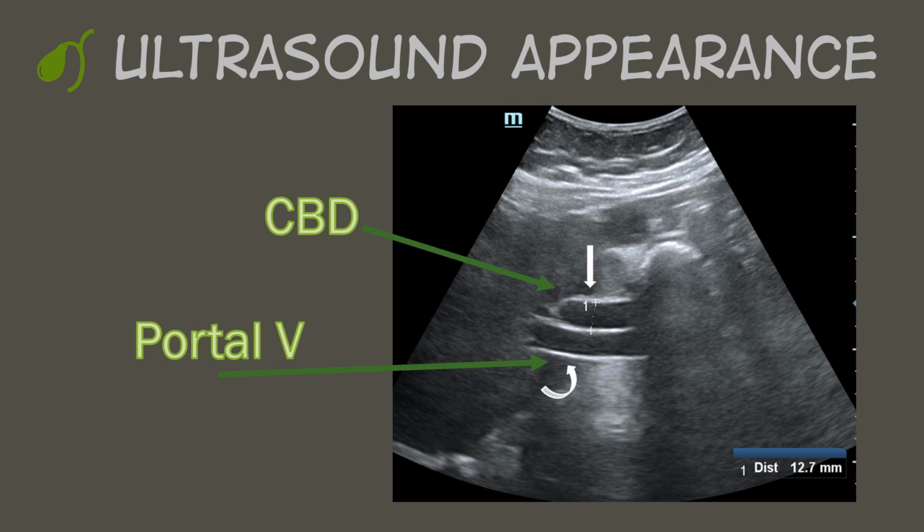You do want to make sure that you are taking a good look through your common bile duct. See if you can see a stone or sludge or tumor. See if you can find that reason for obstruction.